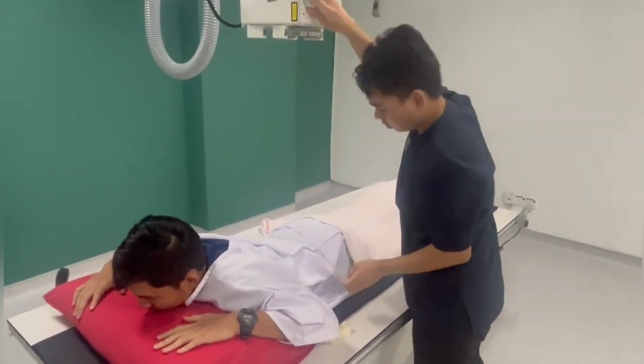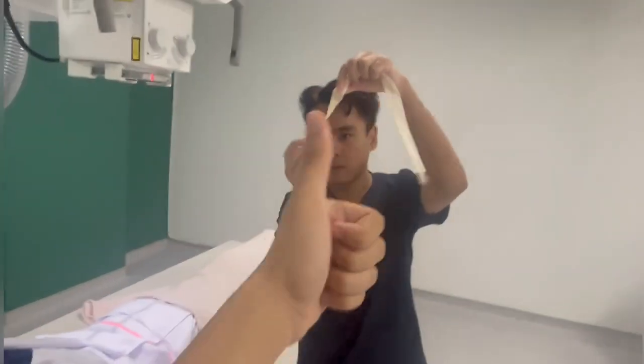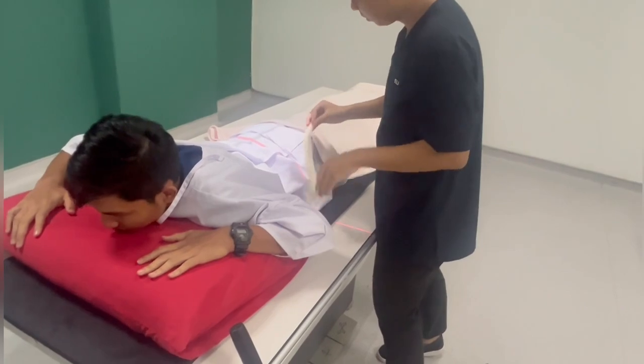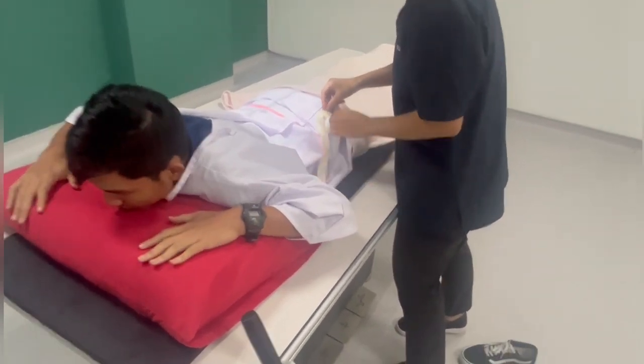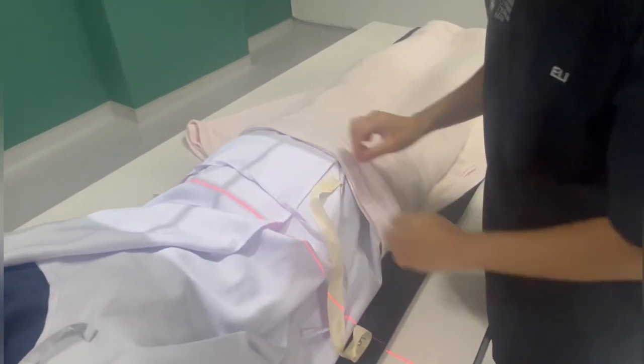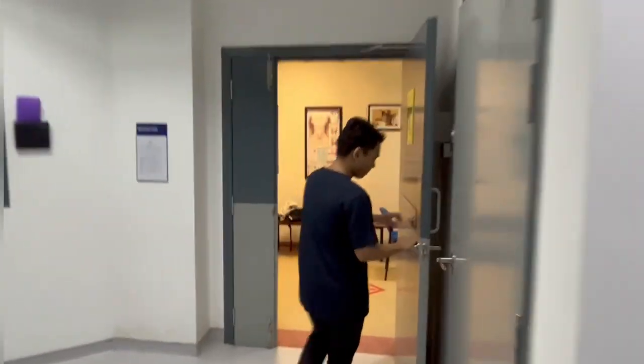Collimate the patient: superior at the diaphragm, inferior at the symphysis pubis, and lateral at the skin margin. The marker for the left side will be put and must be flipped since this is the PA projection. Then we put the marker at the appropriate side. So this is its place. Now you can tell the patient not to move and to follow the instructions later.